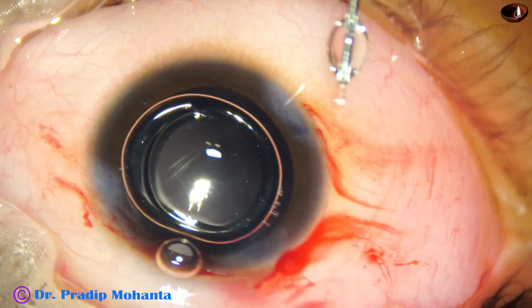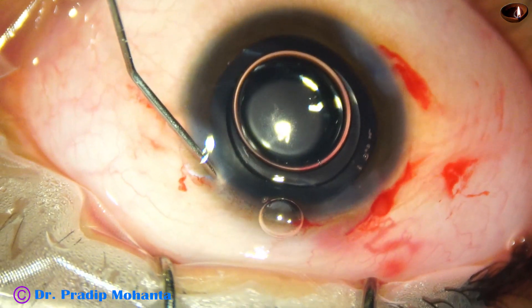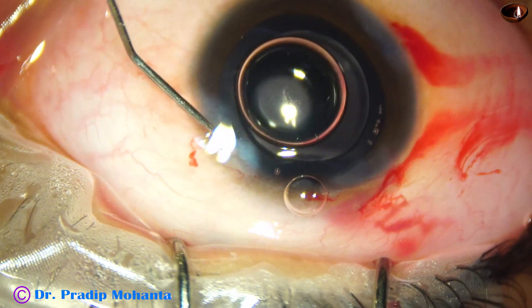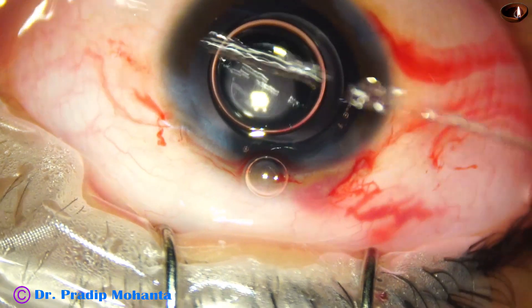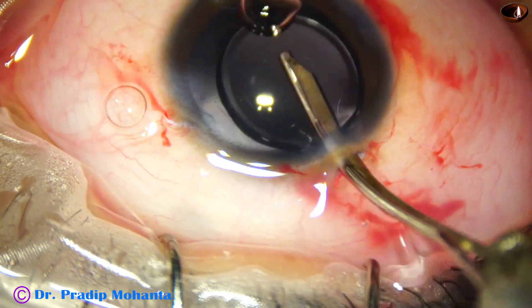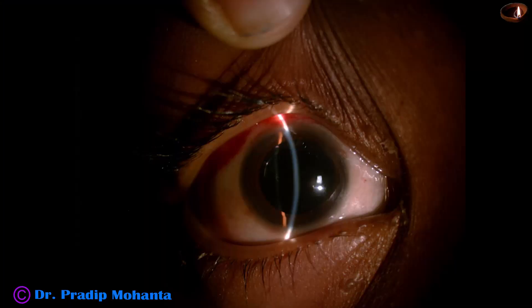At this time the patient was moving his head. When the anesthetist is with you, it's a big relief — even if the patient is not cooperative, you know the anesthetist will manage. So after closing the side ports, this is the final lavage of the anterior chamber. If there is no leakage from any wound and the wounds are very nicely sealed, we can opt not to put a suture.